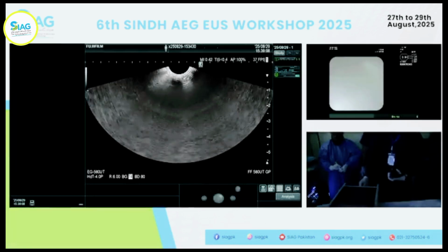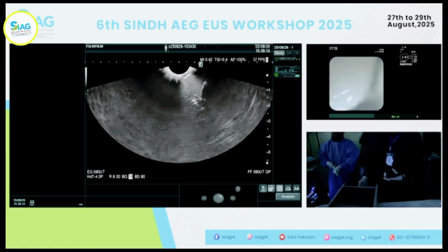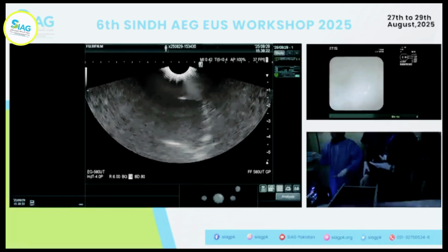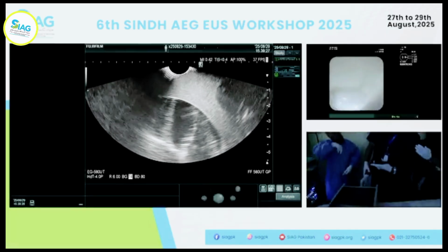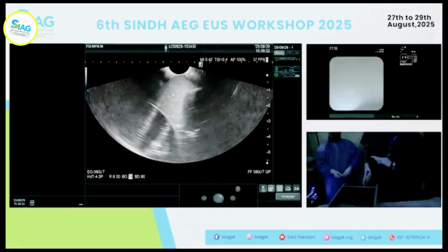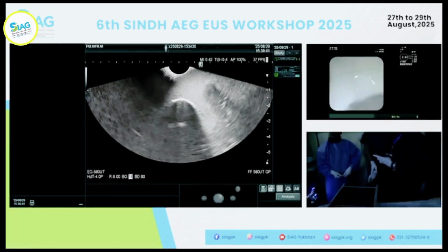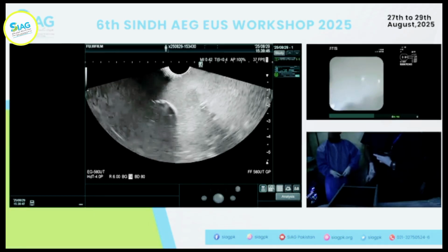चलो जाओ आगे जाओ। और जा रहा? ओके, मैक्सिमम। पीछे आए, slowly पीछे आए and just rotate a little bit and see. All right. आगे लगाएगा पीछे। चलो ओके, थोड़ा सा लिफ्ट करें अपने बिग व्हील को। और पीछे आए और पीछे आए और पीछे आए। ओके, now lift up और पीछे आए। ठीक है, Khalid, now पीछे आए। जी, we see it.